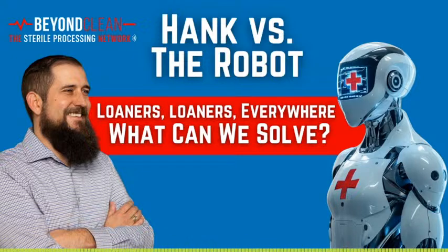Switching gears a little bit, I've gotten some flack through the years with my belief that part of the gap in this process, especially in terms of efficient processing and productivity for loaners in sterile processing, is the idea that out of all of the instruments that come through our workflow, loaners are the kinds of instruments that we know the least about as sterile processing technicians, because we don't own these instruments. We're not trained as thoroughly, if at all, on the specifics of the instruments themselves. We don't know what they're called.